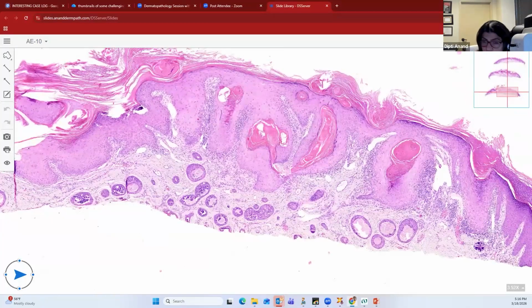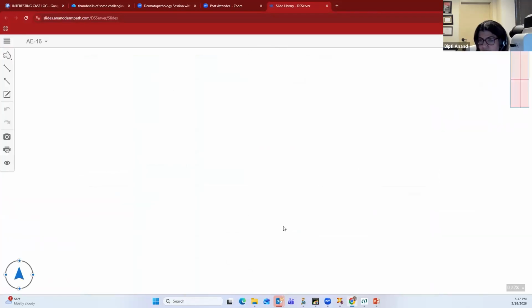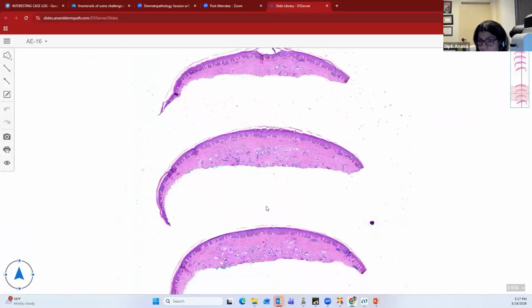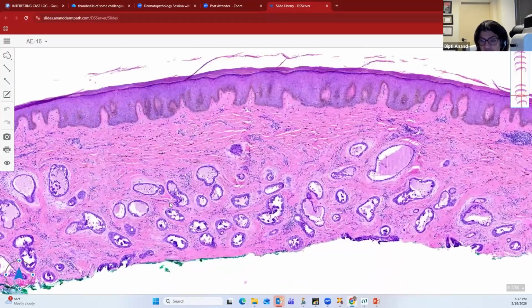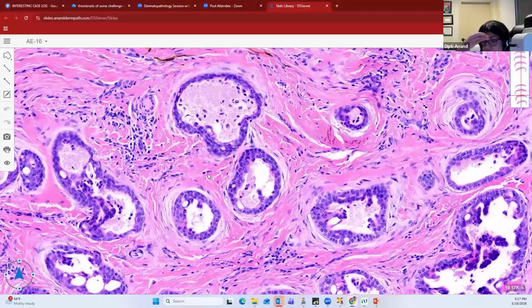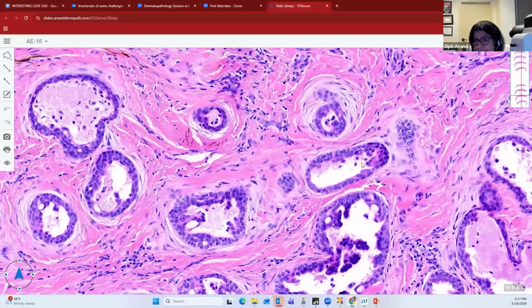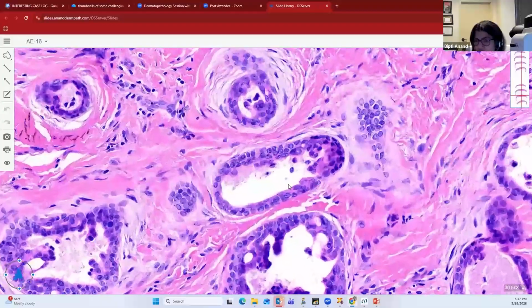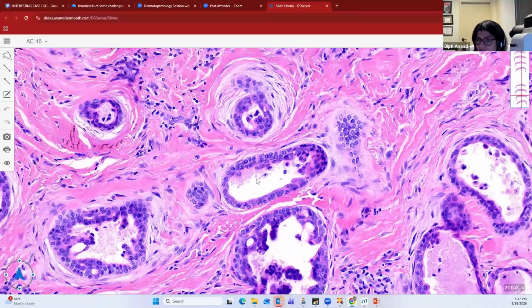But I'll show you a papillary eccrine adenoma that also looks really similar, but that occurs most commonly on the extremities, on the hand. So you can see here the thick acral skin. You again have the tubules and the ducts in the dermis, and the lining epithelium is again bilayered. So this is again an important clue. When you see ducts lined by bilayered epithelium, by bilayered you mean there is an inner and an outer. So you can see two layers of epithelium. This means it's benign because the outer is the basal layer.